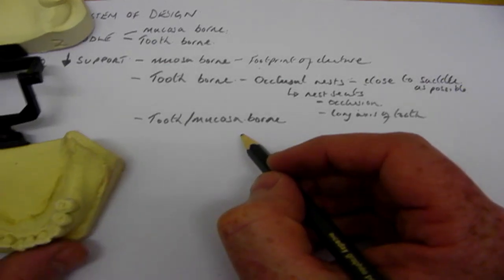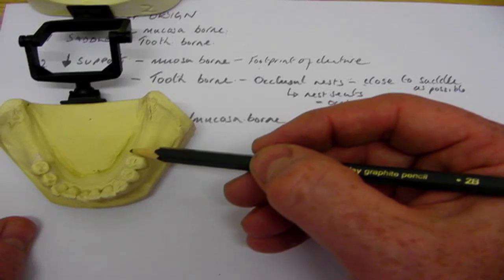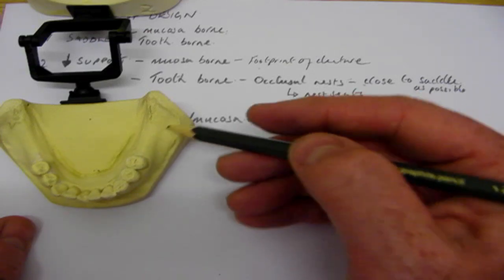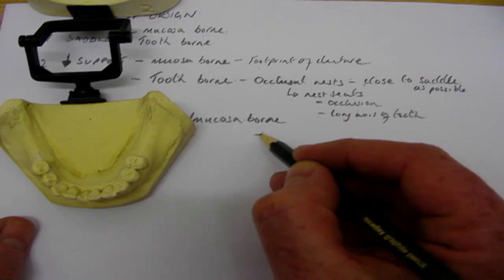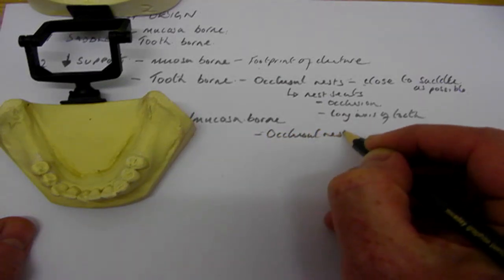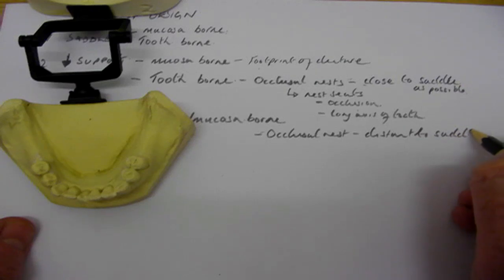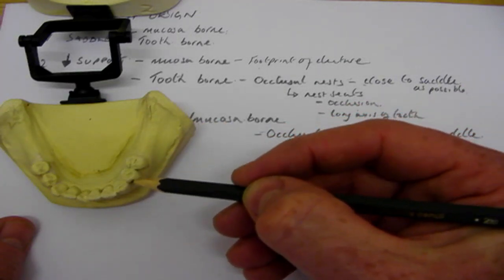And there again is a simple rule of thumb: when you're designing your occlusal rests for these tooth and mucosa borne dentures, where we've got a free end saddle, we want to put the occlusal rest distant to the saddle area. It wants to be at least the opposite side of a clasp tip to the saddle area.